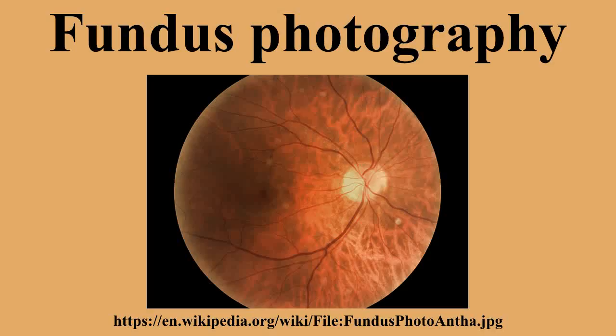Resolving artifact in fundus photography. Artifact errors in fundus images are caused through the improper setting up and alignment of the patient, examiner and the fundus camera. Patient cooperation and attitude are crucial to minimize artifacts. The clinician must ensure that the patient has understood the instructions. They must also correctly align, set the camera controls and make decisions concerning film choice. Each of these factors must be taken into consideration when evaluating a fundus photograph.